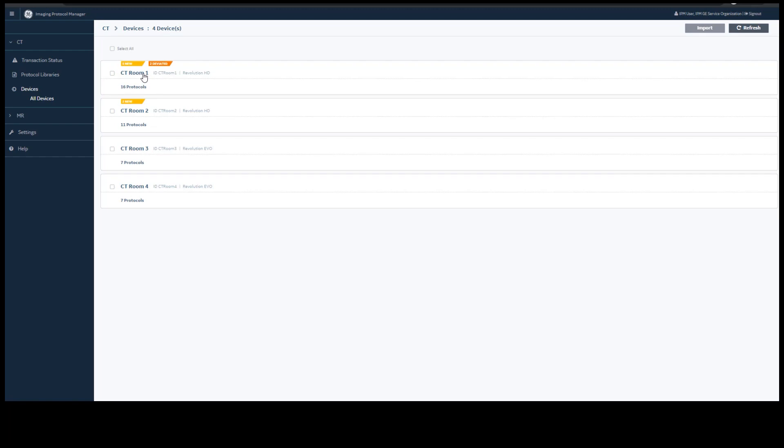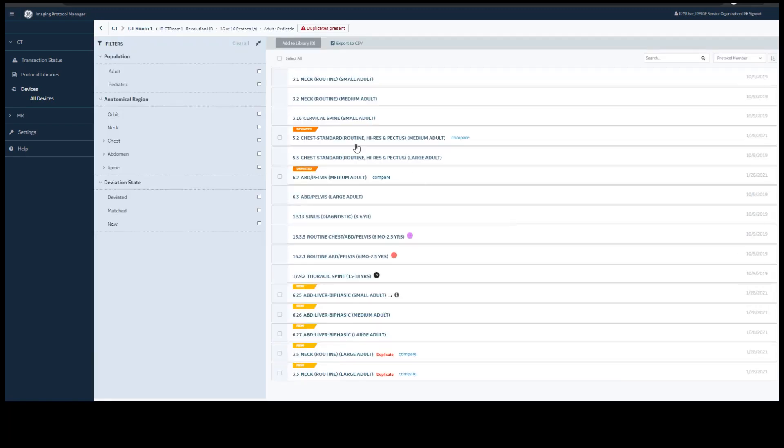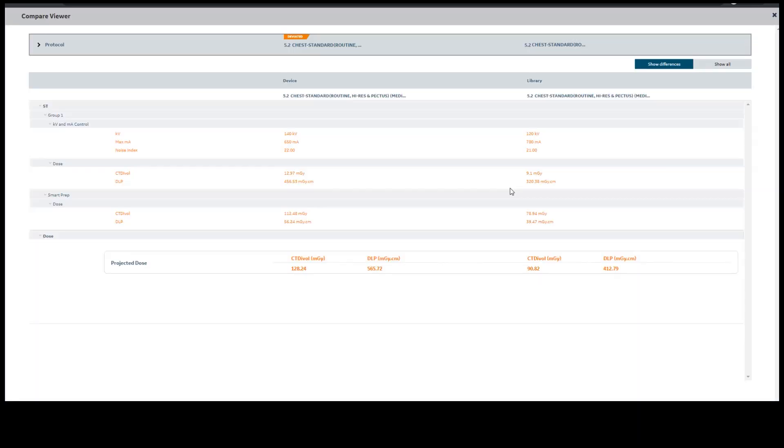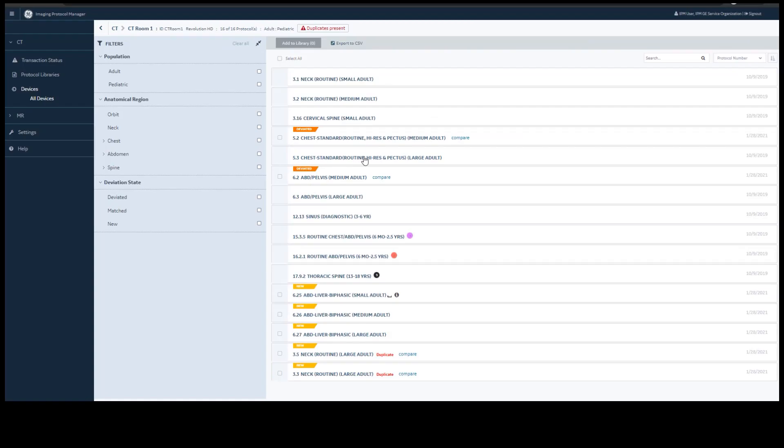Looking into CT Room 1, you can see all protocols that are on your device. You can use the Compare function to look at those deviations or differences from your standard protocol. You can see your device protocol and your library protocol.